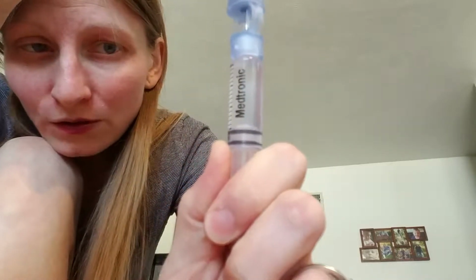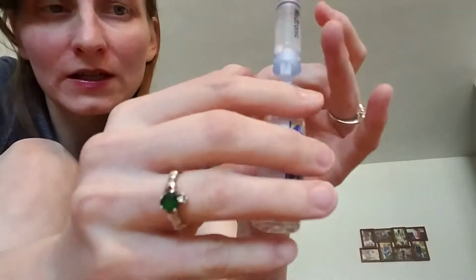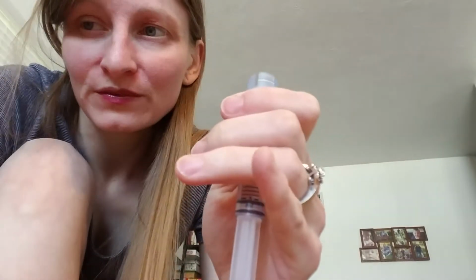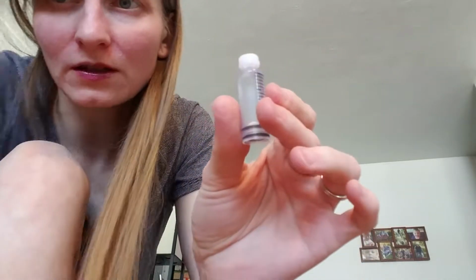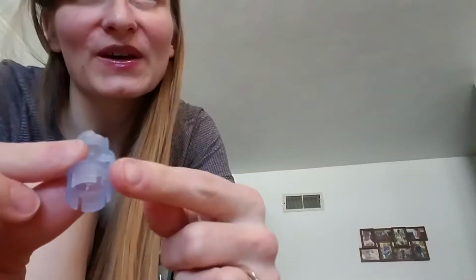So I gotta get it down to that 3 line, right down there. Turn it upside down to see if there's any bubbles that come to the top. Not seeing any. This is always a pain in the butt when you run out of insulin at like midnight or something, and you have to do this in the middle of the night. Not exactly fun. So it's nice that it's happening right now. Well, there, that's full. I took the needle out. There's a needle on both ends: the end that goes on the cartridge and the end that goes on the insulin vial.